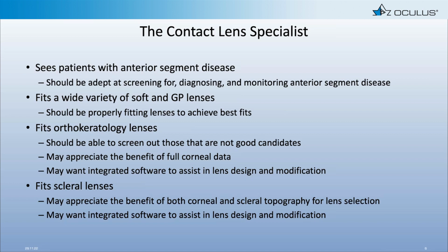I want to fit my patients in lenses that fit them the best, because that means I have the greatest chance of that patient being successful with their lenses, because not only have I picked a material and a modality that's best for that patient, but I'm putting them in a lens that actually fits their cornea properly. And to do that, I've got to measure their cornea.